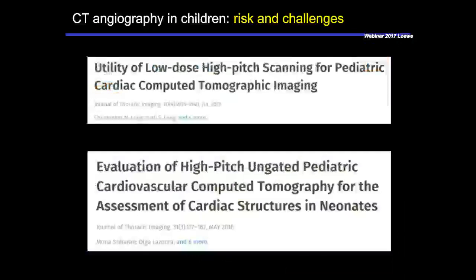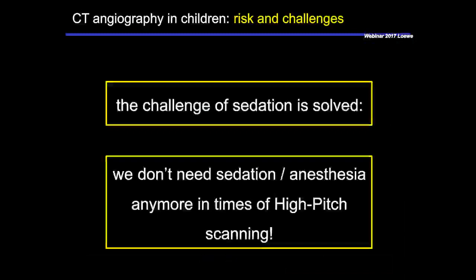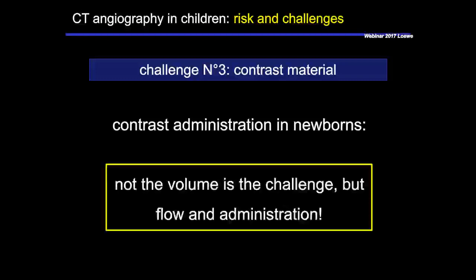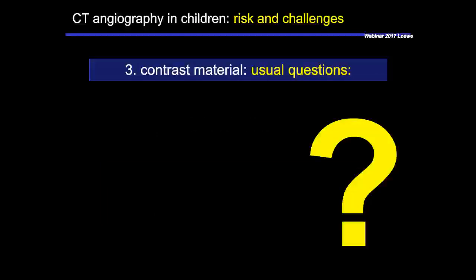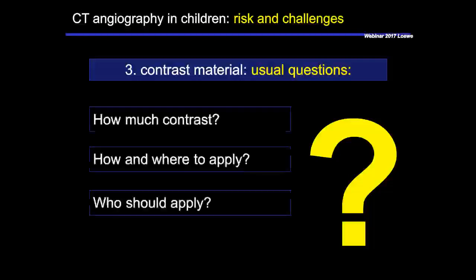So the challenge of sedation, the second really huge challenge of examination of small children, is solved because we don't need a sedation. A very elegant problem-solving strategy here. The third challenge is always about the contrast administration. In fact, nowadays, not the volume is the challenge, but the flow and the administration. So when we're talking about the contrast administration to children, we have the usual questions: how much contrast, how and where to apply, who should apply, and how to time the injection.